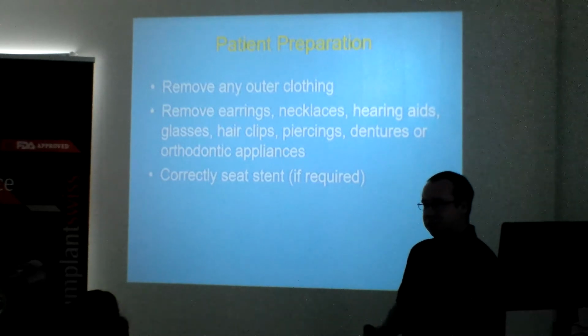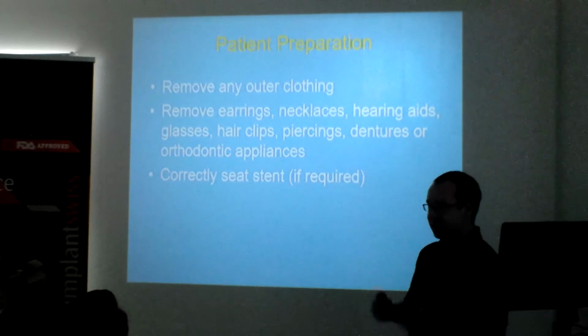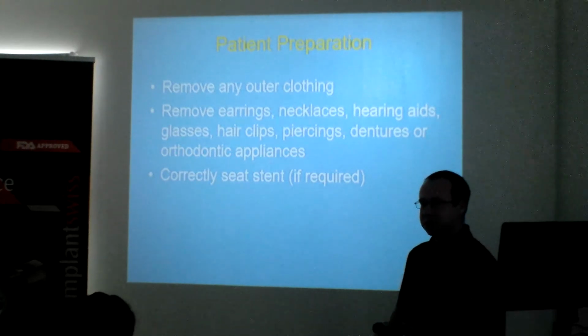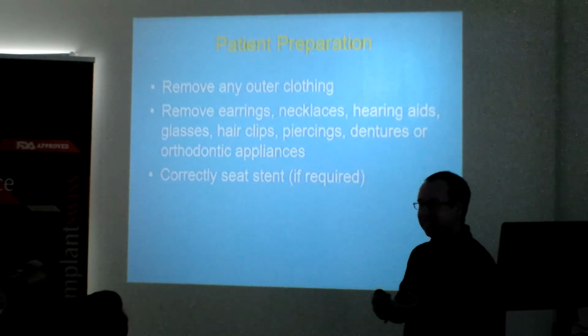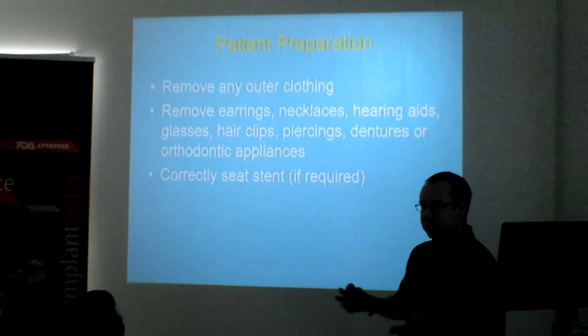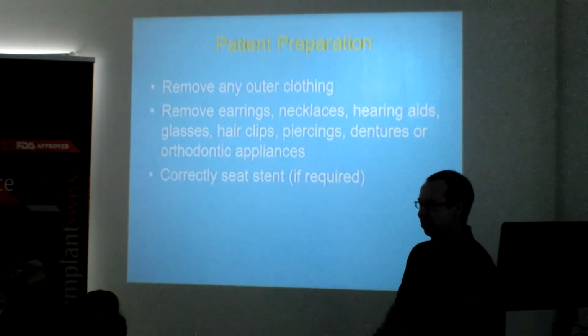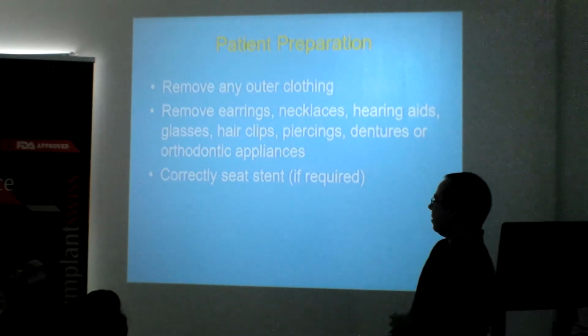Radiographic templates, if you use those, piece of advice, always make sure you try them in the patient before you send them for a scan, because there's nothing worse than a patient coming in and the template doesn't fit or it gets stuck. Or the patient has tried to play with it at home and they come into us and it's broken in two, or there's something missing from it. So people do strange things when you give them the thing.